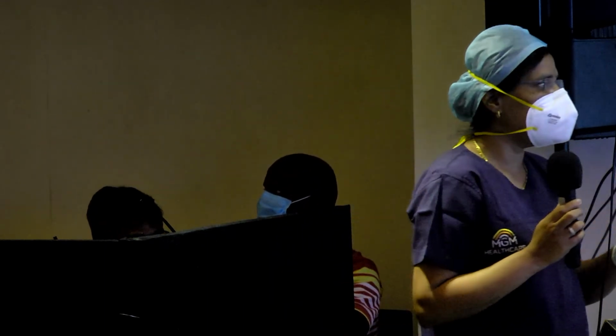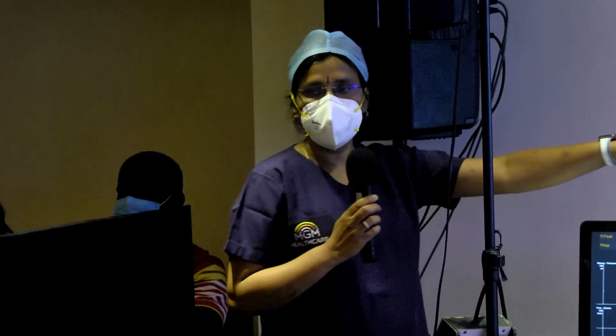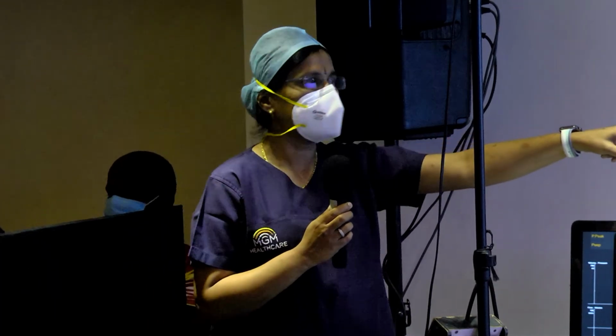Yeah. So just go to the previous one. This is an echo for the same patient, and if you can see, there is an LV vent in the ventricle. So that is how it looks.